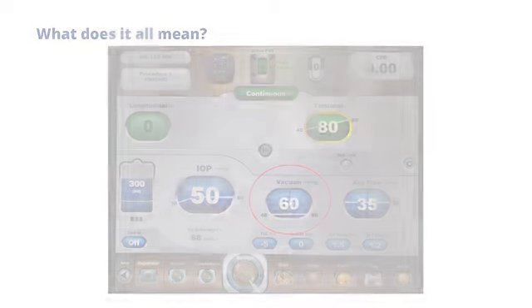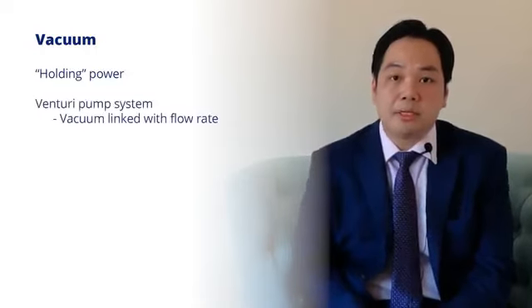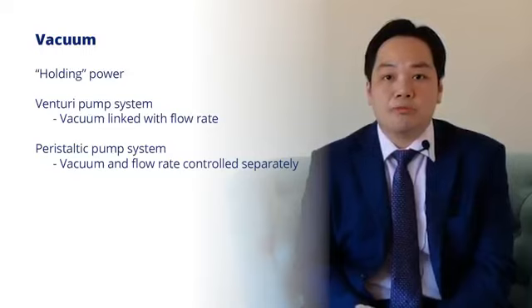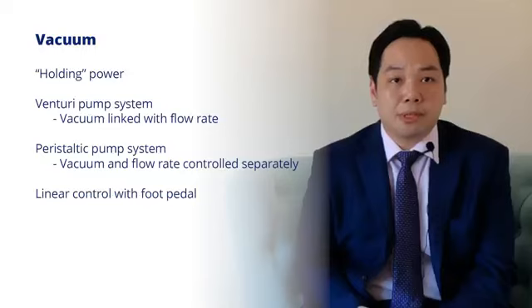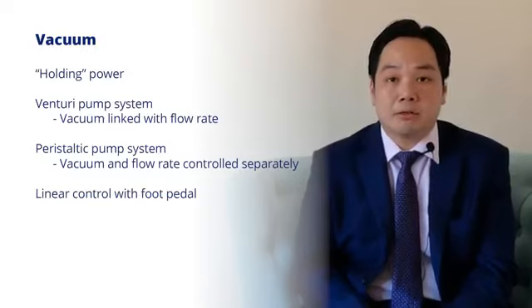This is the vacuum. The vacuum is actually what's removing or the holding power. So the different pumps in the different machines will give you different control of the vacuum. You have Venturi pumps where the vacuum is actually linked with the flow rate, and you have a peristaltic pump system where the vacuum and flow rate are controlled separately. So the linear control is usually with our foot pedal. As you know, when we operate, the amount of treadle or how we step on the foot pedal will deliver different aspects of the vacuum to us with linear control.